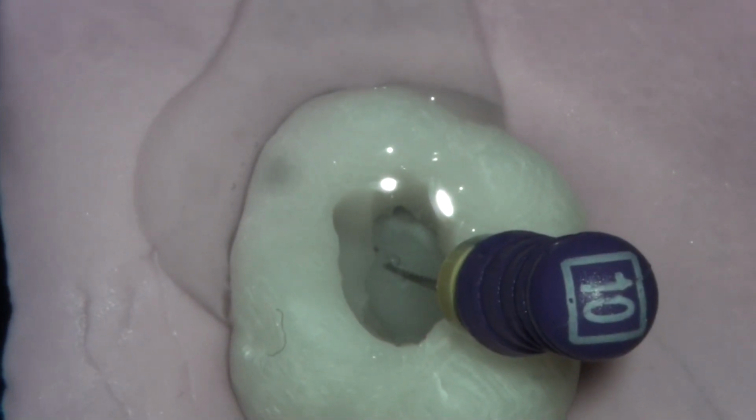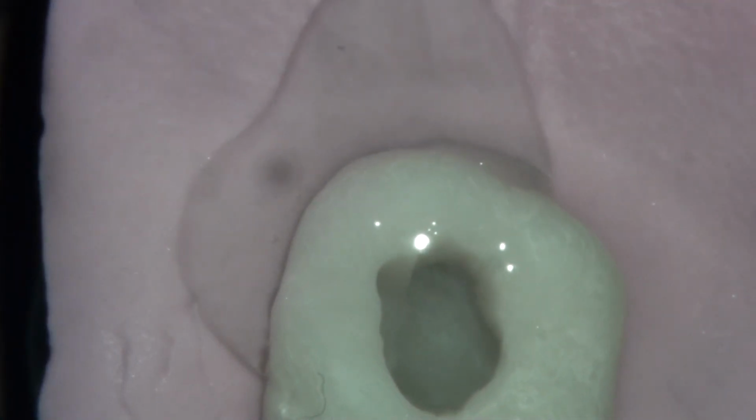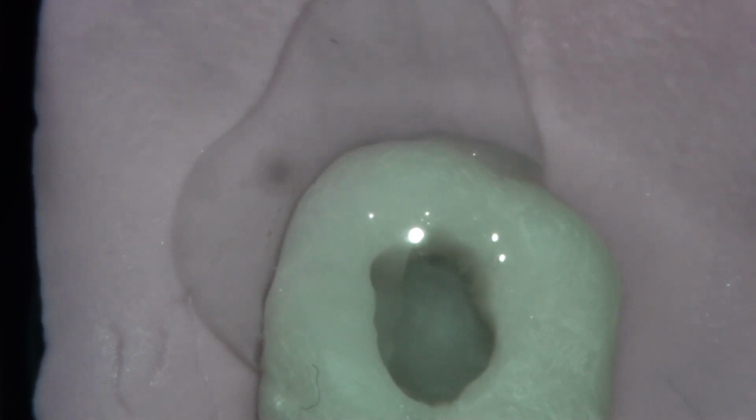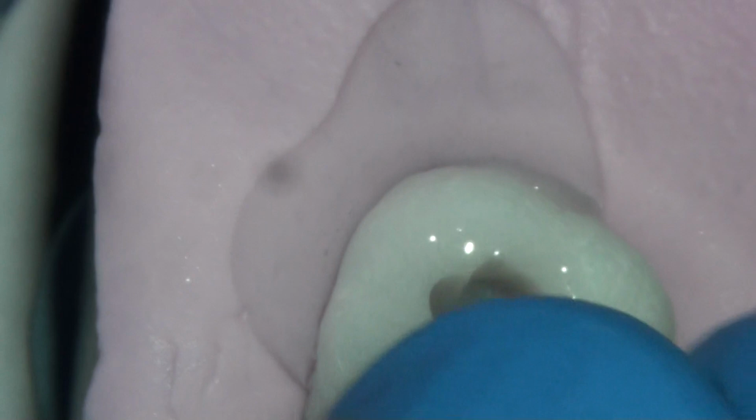Now remember, this canal can follow quite a tortuous course, so we've got to be very, very careful, and we're watch winding and pulling, watch winding and pulling, without apical pressure. And once we get a bit of freedom of the file, we start to file in that motion in order to create a glide path in the coronal portion of the root, because otherwise we will just have a file that is binding in there, and it's not necessarily going to create a glide path for us. So again, we can re-irrigate, and we can introduce our file back into that canal, and it goes in a little bit easier, and we do a lot of filing, and that of course is going to create debris.